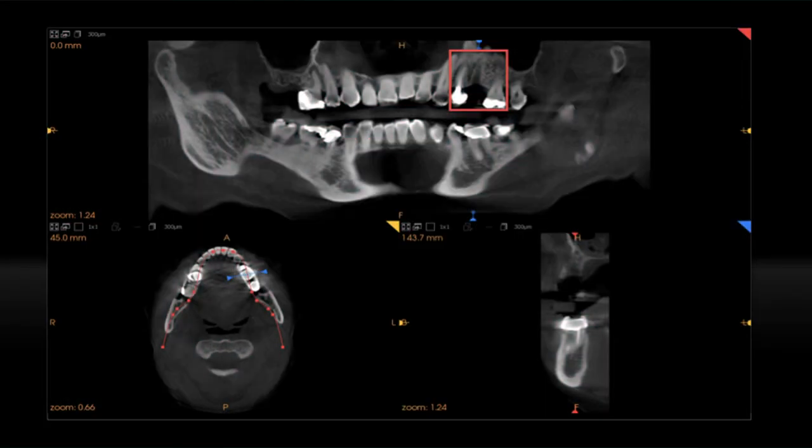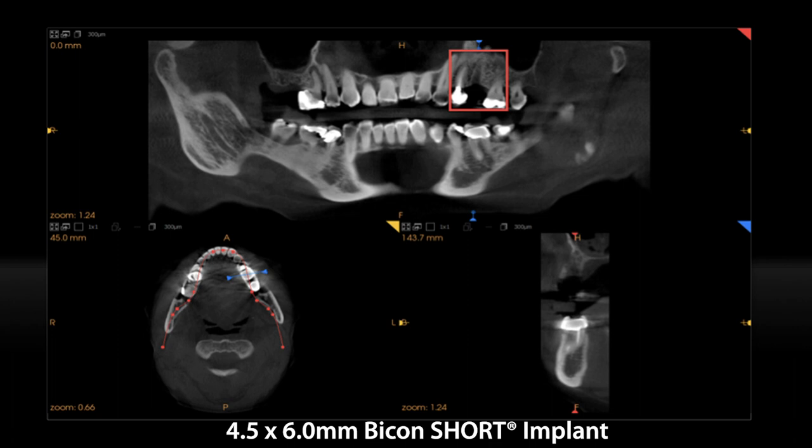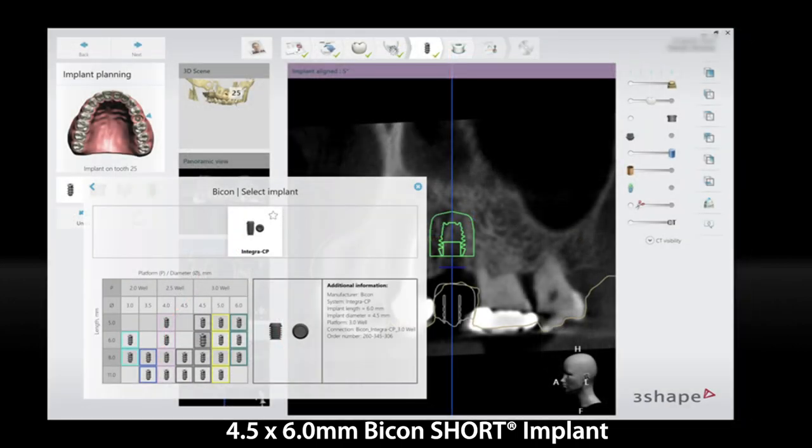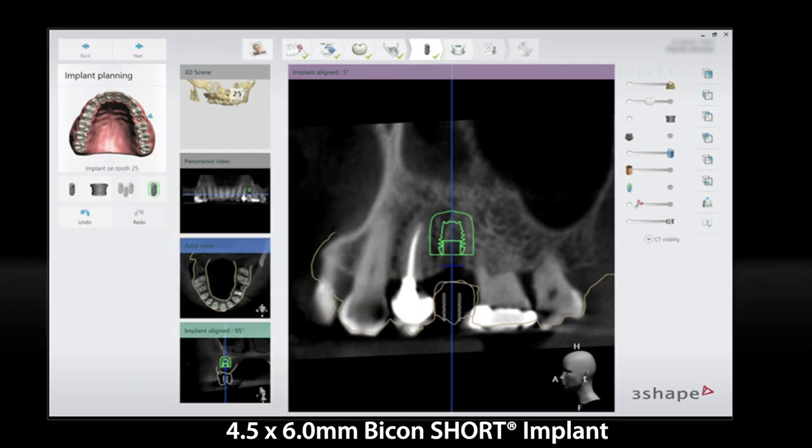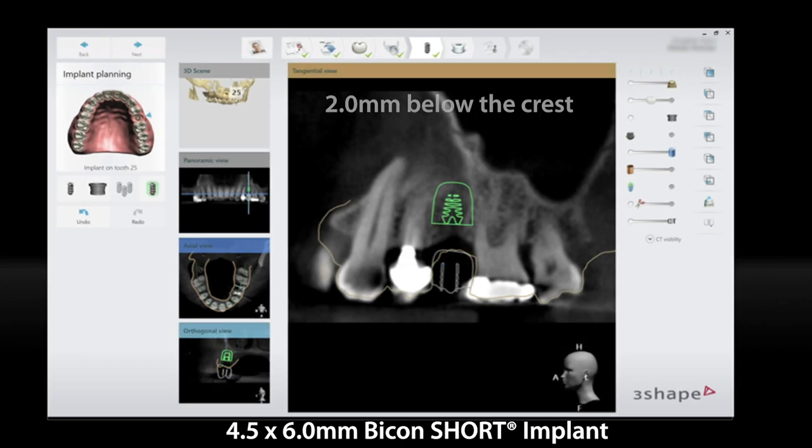It is for a 55-year-old lady presented to replace missing tooth number 25. We have selected 4.5 by 6 millimeter Bicon implants. As I said, in the last case, the use of a partially guided protocol using a pilot drill was optional. However, in this case, it's obligatory due to the limited edentulous space available at this site, which limits the use of the 4.7 ring. The selected pilot ring allows for a 2 millimeter drill diameter.